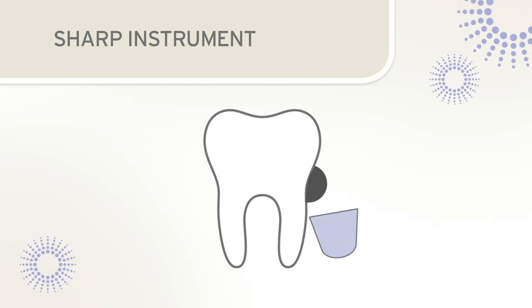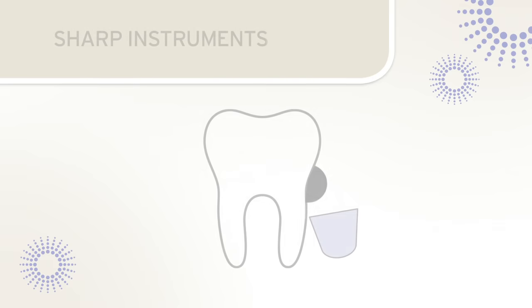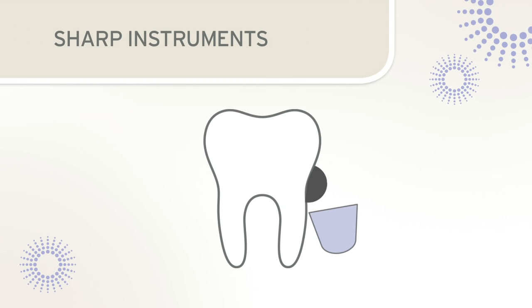Dental clinicians know that sharp instruments are very effective for deposit removal. Repeated use of an instrument wears away particles of metal from the blade, causing the cutting edge to take on a rounded shape resulting in a dull, ineffective edge that can slide over a deposit rather than removing it. With a dull blade, the clinician will need to apply greater pressure and use more strokes to remove deposit. An instrument with sharp edges will readily grip deposits, resulting in less lateral pressure and fewer strokes.